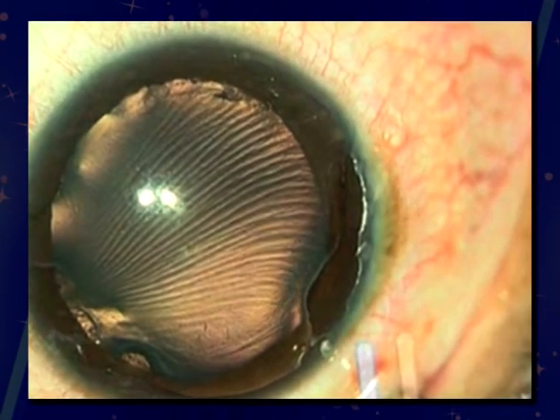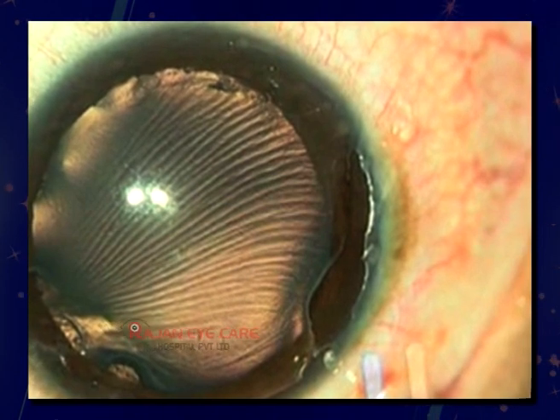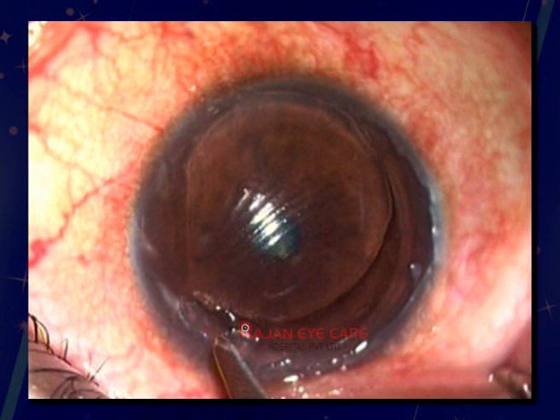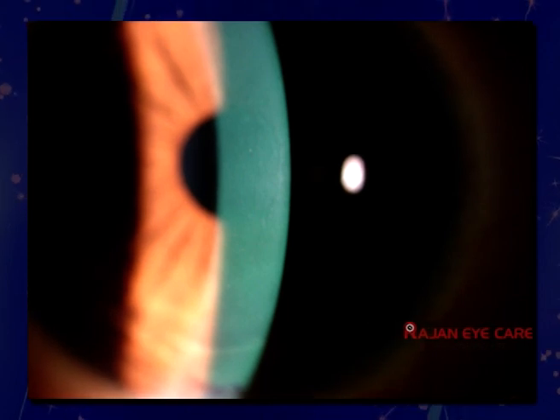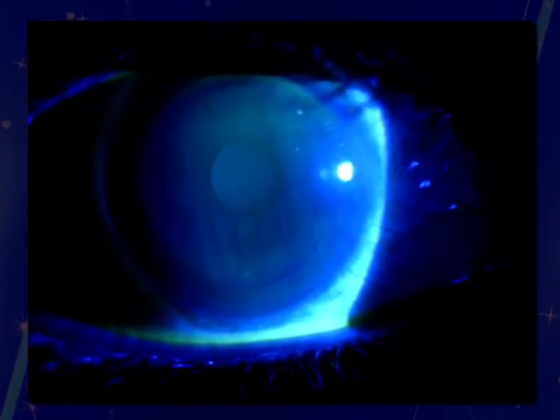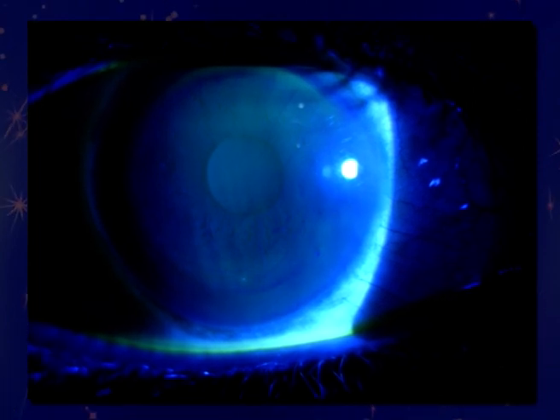Flap striae are defined as small wrinkles or folds in the cornea as a result of LASIK surgery. The most common classification of flap striae divides them broadly based on their size. Microstriae are microscopic superficial wrinkles that are generally asymptomatic and often only detectable on microscopic examination of the cornea. However, macrostriae are larger, full-thickness folds that usually cause noticeable visual impairment.